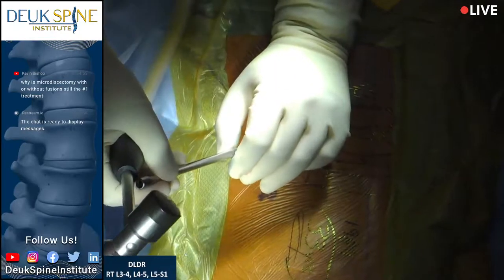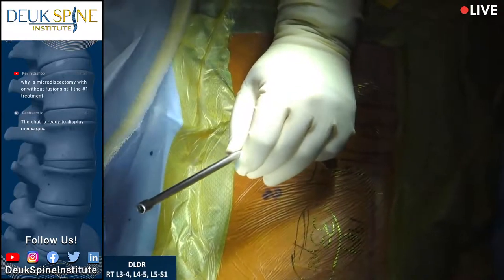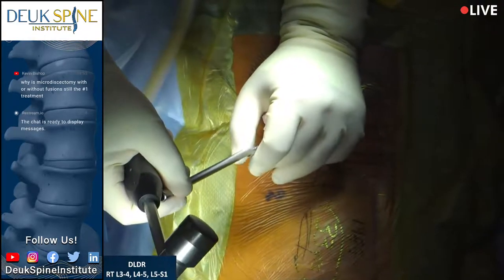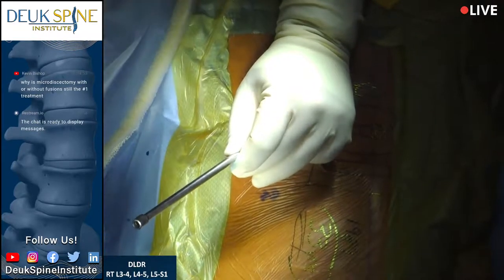So right now we're placing the tube that we're going to do the entire surgery through. And because the incision is 7 millimeters, the tube is also 7 millimeters.